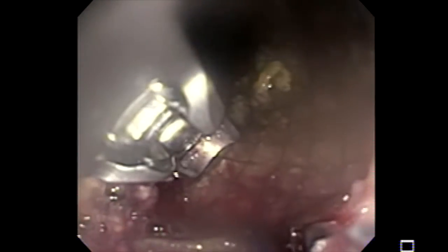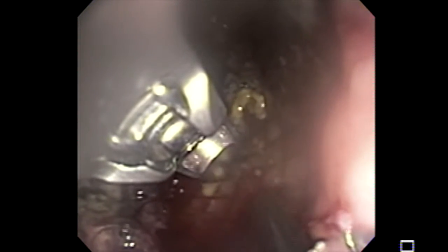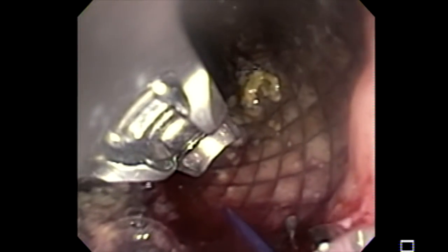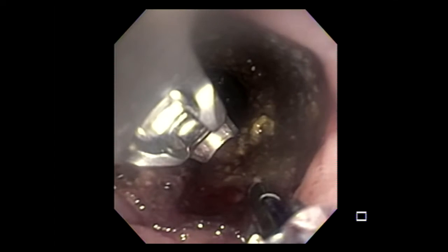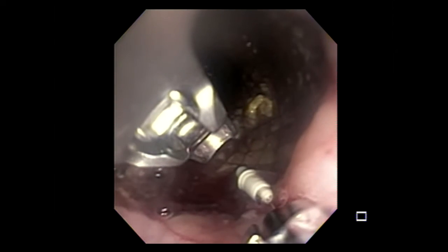Now we already delivered the first suture, and we are grabbing what we call the cinch. That's called cinch design, which will allow us to tie the suture without the need for tying it. What we release right now is a cinch, and then we are going to deploy the suture, because it's already going through the stent and the esophageal wall. That's one way of doing it — you just do one simple suture, going through the stent and the wall.